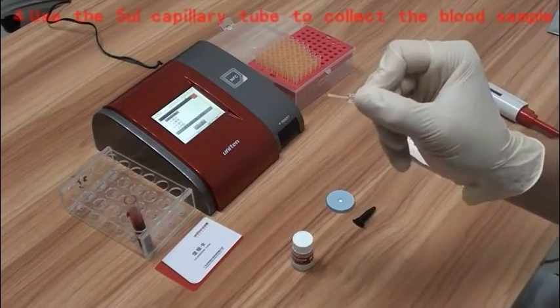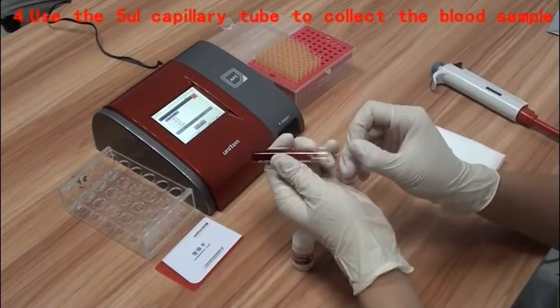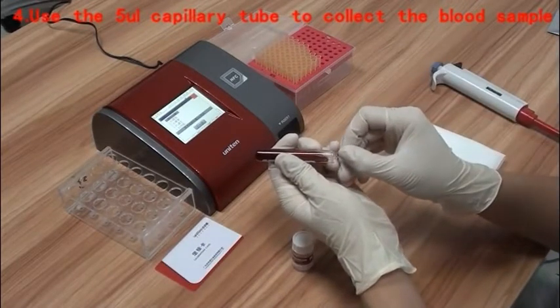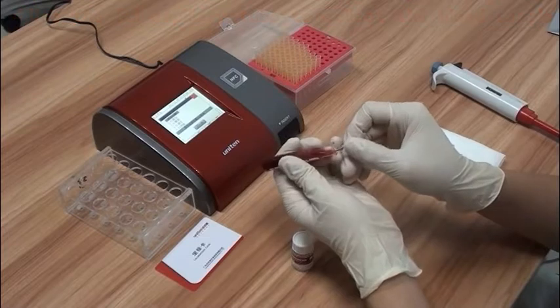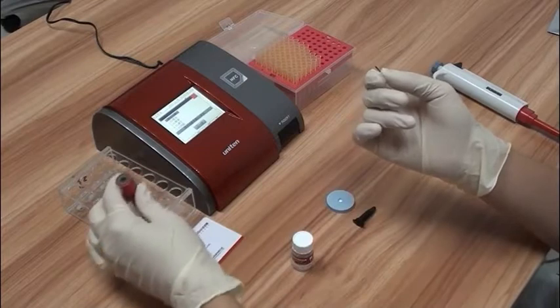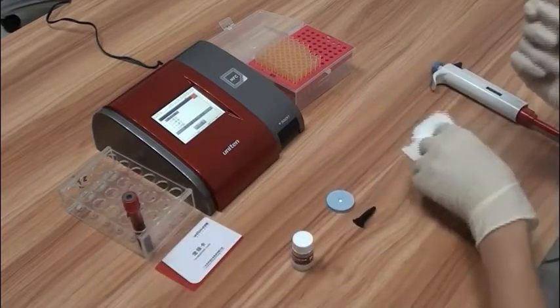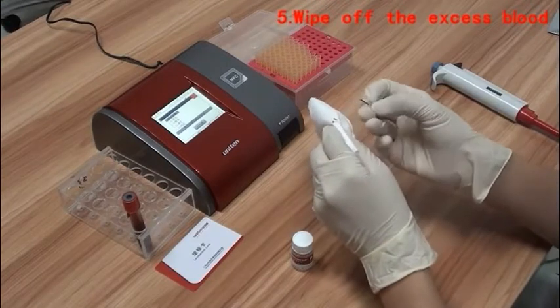Use the 5µL capillary tube to collect the blood sample until the tube is filled completely. Then wipe off the excess blood on the external surface of the capillary tube.